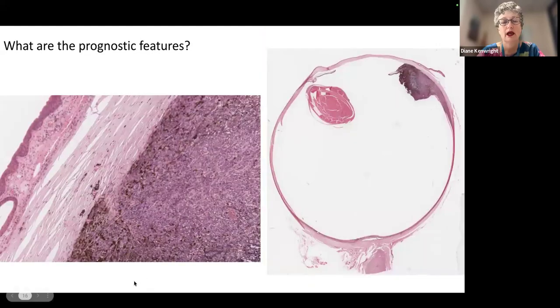Okay, here we go. So we've got another tumor here. Here we have the again displaced lens, anterior chamber. This doesn't seem to be affected, but here we've got a melanoma again affecting the ciliary body and iris, and we wonder what's happening here as it passes through. The optic nerve isn't involved.